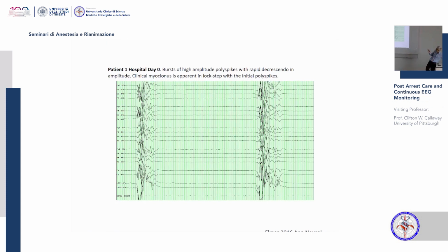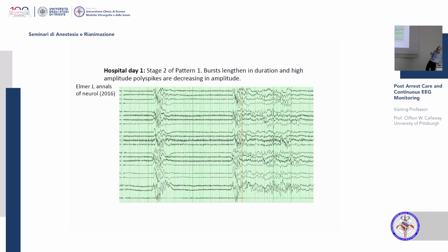Here's one where the bursts come. They're very brief, mostly suppressed. So the background, is it present or suppressed? Suppressed. And then there's a burst, and the bursts look the same. Real spiky, angry looking. Later, it changes a little bit, and you might think, oh, maybe here's some good brain activity behind it. But the identicalness of it is determined by that first half second. So you can see that even though the second one has a little tail, the beginning of it is identical. So these are still identical bursts on a suppressed background.